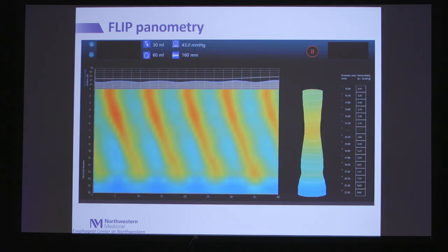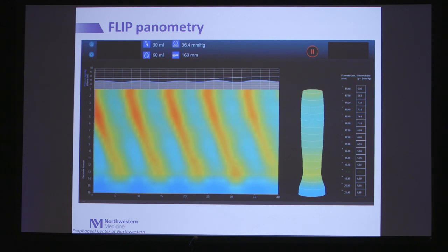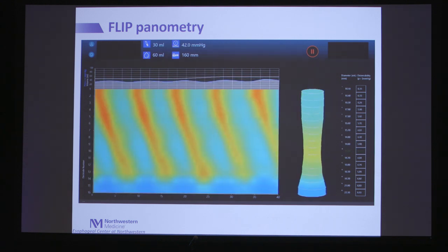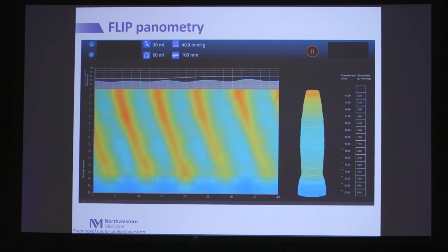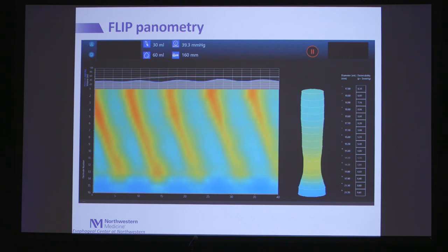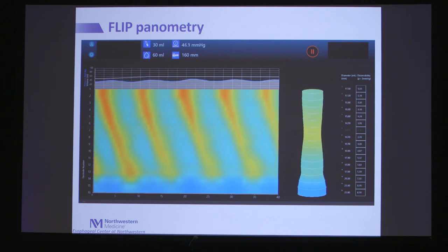The updated display, now available in real time, shows a normal control during endoscopy. You can see contractions occurring in the esophagus as represented by reduction in diameter, the EGJ opening up nicely, and the esophageal body opening up, representing normal distensibility of the distal esophageal body.